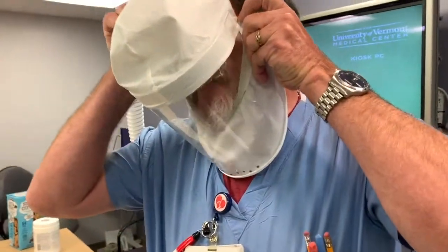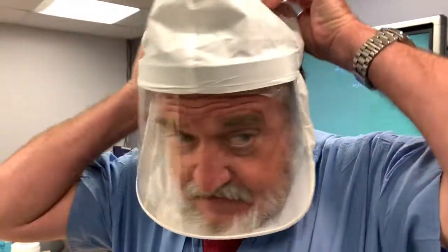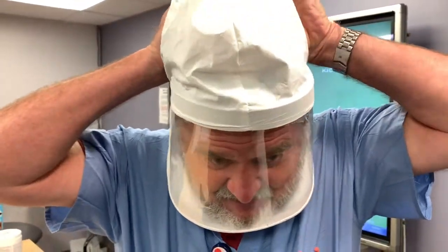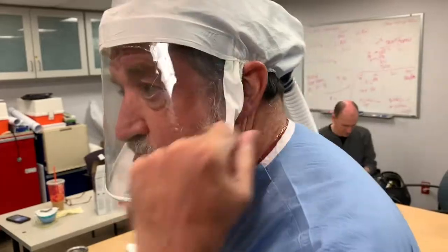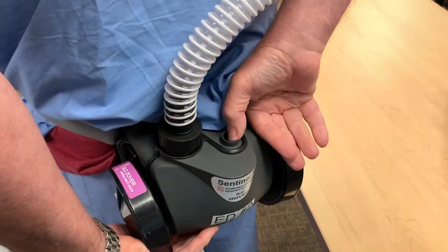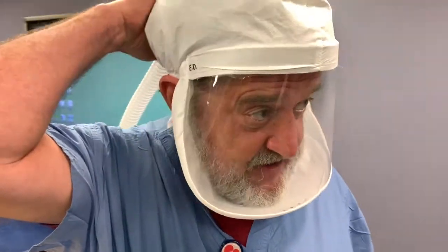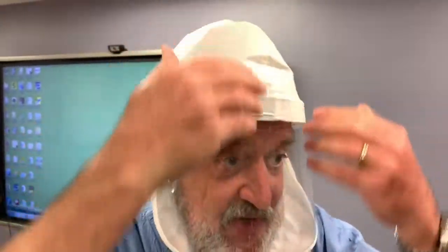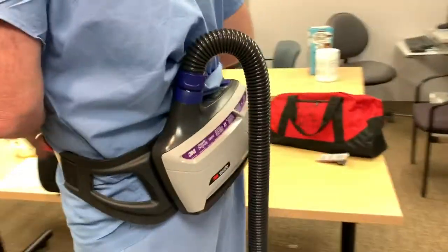When you put it on, you want to put your pin in first. Then you want to press the on button, which is right here. I now have filtered air coming into the back of my head, flowing down over my face, and exiting here. We also have several new ones which have a different centerpiece for the tubing and headset.